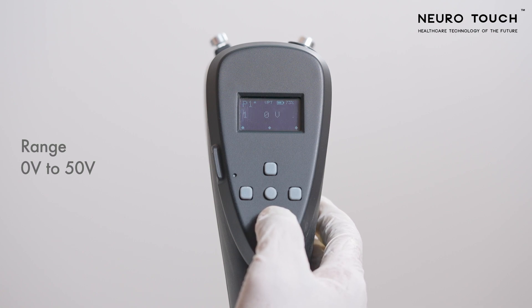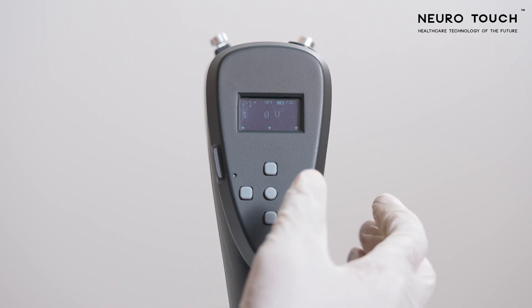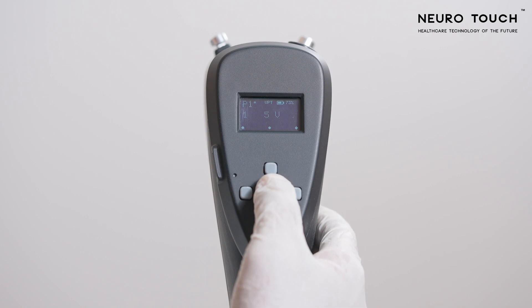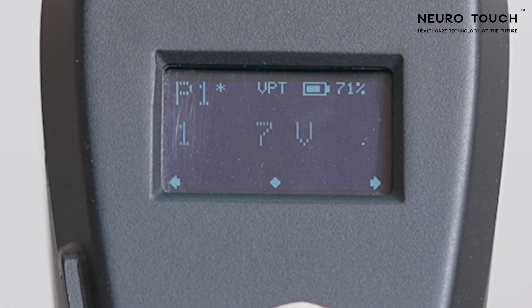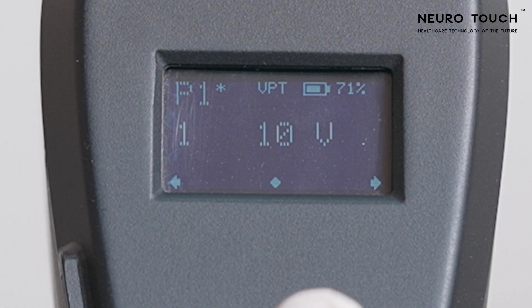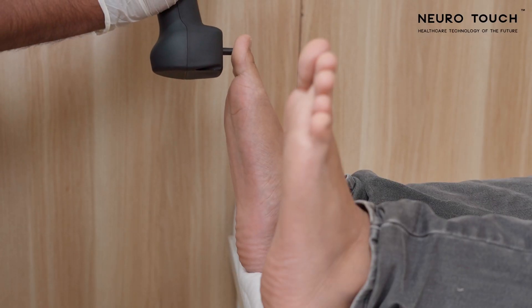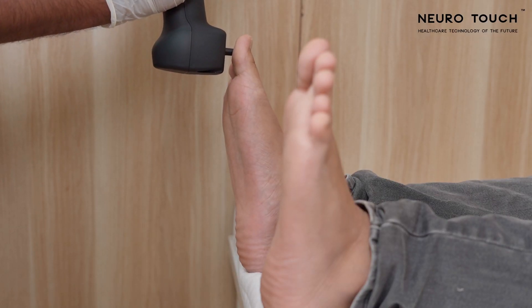Vibration Perception Test. Click the bottom key to start the vibration perception test. To perform the vibration perception test, set the voltage to 10 volts by clicking the up arrow key. You can use 10 volts as the starting value for all 12 test points. Place the vibration probe against the patient's test point and take feedback from the patient.